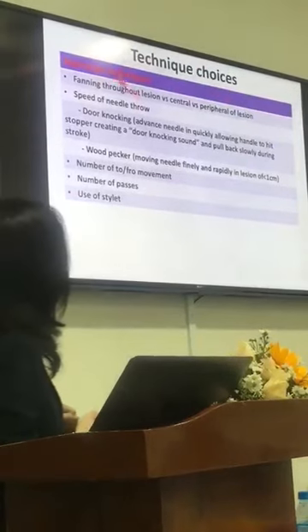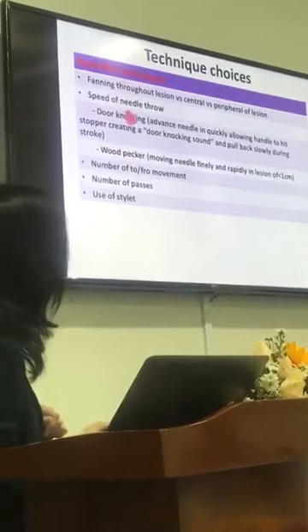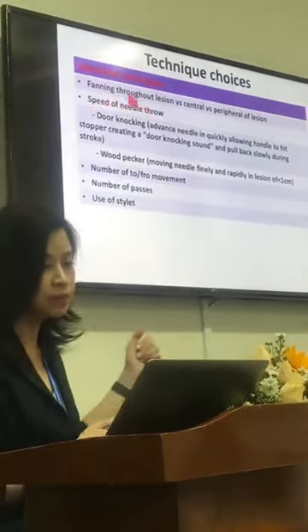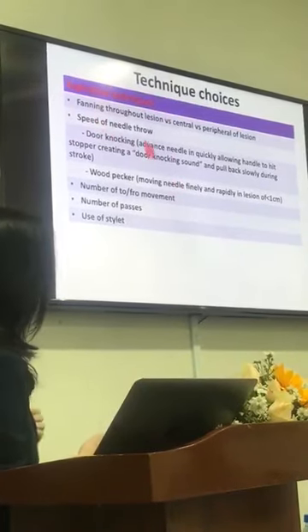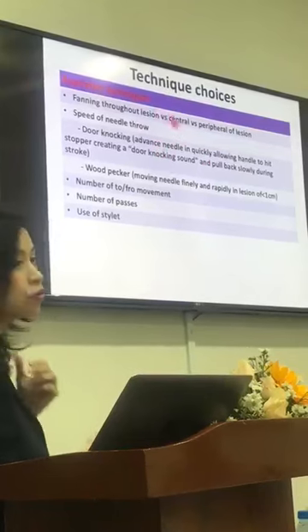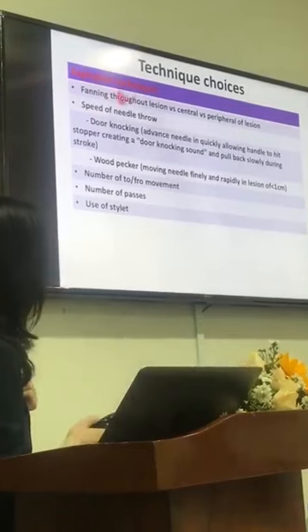What are the technique choices? Aspiration techniques, people talk about fanning technique. We'll talk about fanning technique in a little bit. People ask if you should do the fanning technique throughout the lesion, or you should pick the center of the lesion, or just the peripheral area. We don't know.